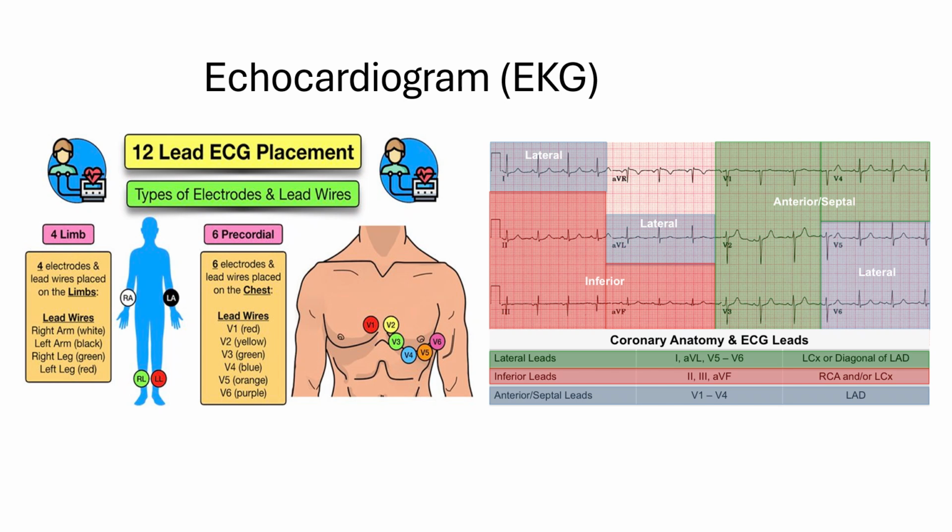to more pinpoint the specific areas and whether we have a problem with our atrial depolarization or if the problem is occurring within the ventricles. Now, although the 12 lead is pretty comprehensive, it doesn't always give us the greatest view of the right side of the heart. So sometimes, if we suspect that there are issues occurring on the right side, you may see them use a 15 lead EKG and sometimes even an 18.